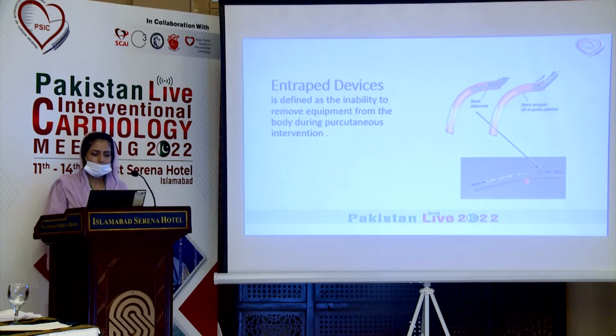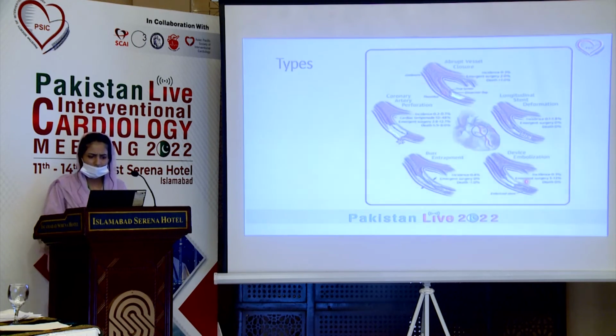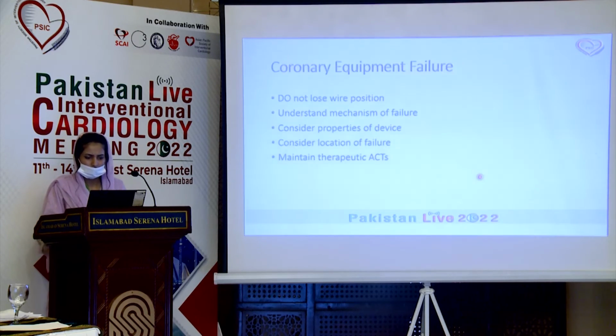The fourth complication is entrapment of devices. It is a potentially life-threatening complication, the inability to remove equipment from the body during percutaneous intervention. There are different types of entrapment of devices. Management of coronary equipment failure for the interventionist: don't lose wire position, understand the mechanism of failure, consider the properties of the device and location of failure, and maintain therapeutic ACT.